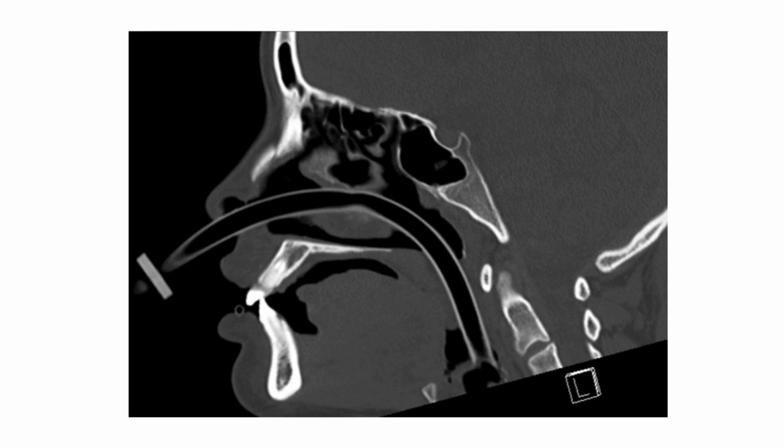But if you look really closely here, because it's sized inappropriately, it's much too large for her face. It's actually pushing her epiglottis down and occluding her airway. So when you're using these adjuncts and you think that they're helping, this adjunct is actually causing a much bigger problem for her than helping, because it's pushing the epiglottis down over her airway. So all of that air that we would think is going in is probably going directly into her stomach.